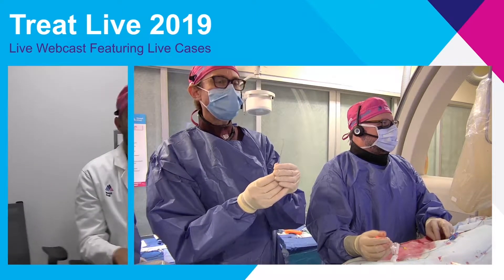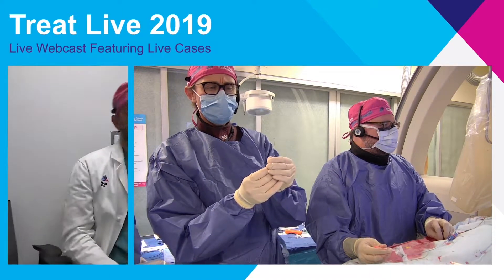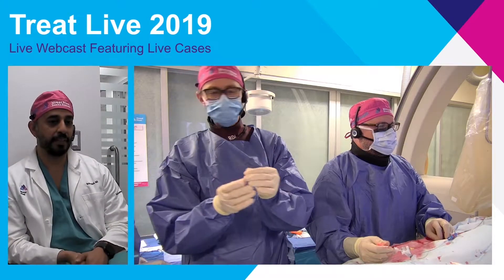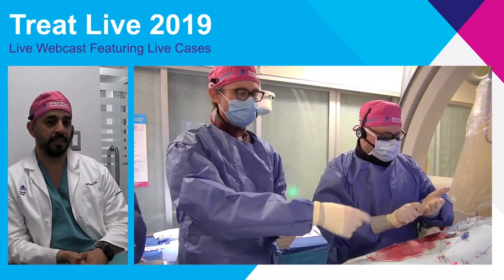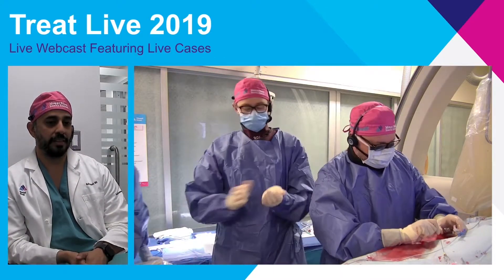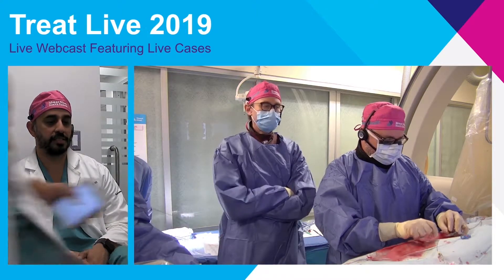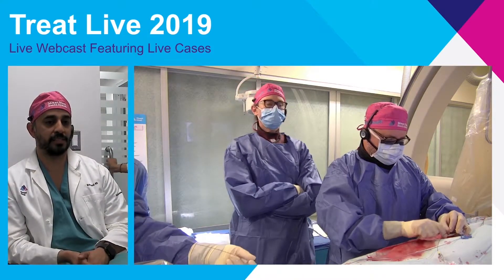We've got an unruptured right MCA bifurcation aneurysm. Our fellow Kurt will run through the clinical vignette. It's coil embolization for an unruptured MCA aneurysm.